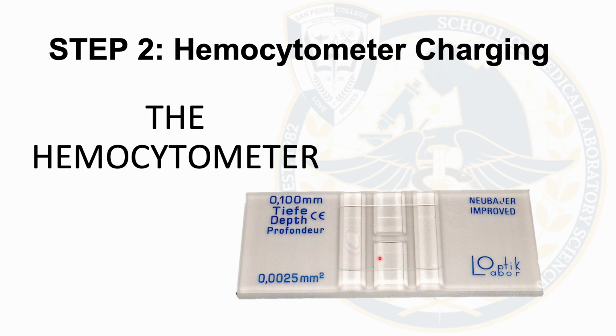So, again, this is your hemocytometer. This is a calibrated hemocytometer. That means when you check inside, it has lines. This is one chamber and the other chamber is on the other side. You put sample on both ends, and make sure there are no bubbles. We don't want that. At the same time, the number of cells on one side should coincide with the number of cells on the other side, because it's the same sample.